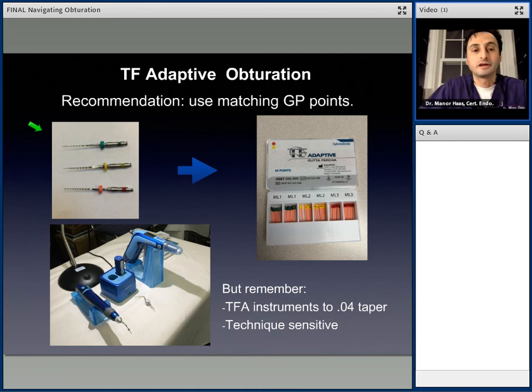But keep in mind, many people do recommend using a narrow taper so as to somehow preserve some dentin. As far as I'm concerned, the difference between an 04, 06, or 08 taper instrumentation, practically speaking, is not going to make a big difference in terms of structural integrity of the tooth. But the reality is that we need to have a greater taper in order to make irrigation of the canal easier, to be able to get your lubricant there, and make your obturation much easier. The narrower the taper, as you can see in my hand, the more difficult it is to get in there. The wider the taper, the easier it is to get your obturation to length. So if you're using an 04 taper of instrumentation, obturation with this injection gun over here, for argument's sake, and this hot instrument becomes a little bit more difficult.